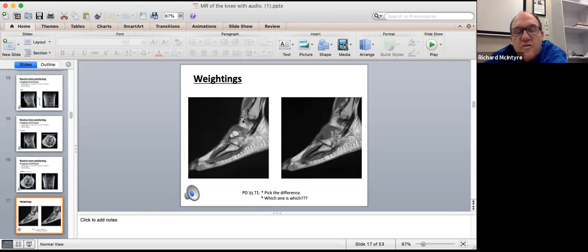And I got terribly confused. And then I had to go home and have a little cry because I thought I knew everything. But now I realise, well, no, it's the TR and the TE and the times of relaxation that determines whether the fluid's bright or dark. And most of the parameters that we use in MSK for proton density, the fluid's bright.